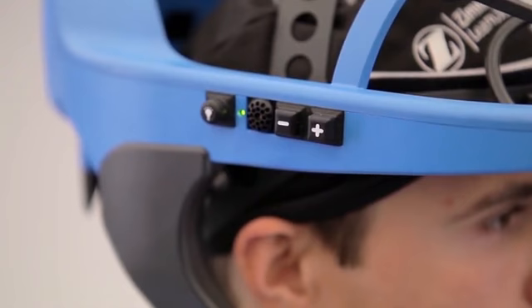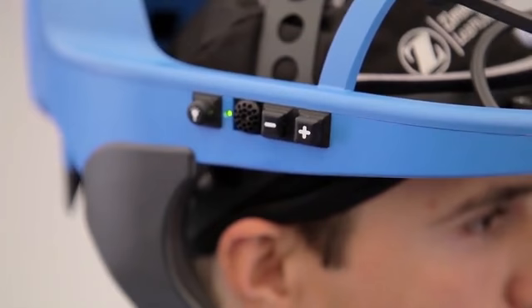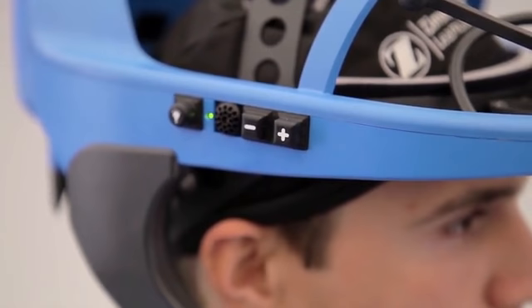To adjust the helmet fan speed, press the fan speed control buttons which are indicated by a plus sign and a minus sign. You can increase the fan speed up to 5 times. Each increase will produce a single audible sound. Decreasing the fan speed using the minus sign will produce a different sound, and no sound signifies when the minimum or maximum speeds have been reached.